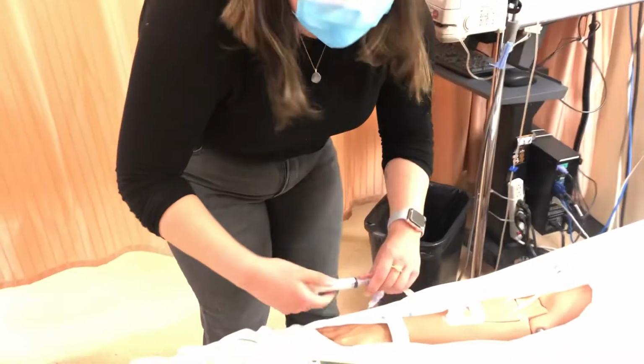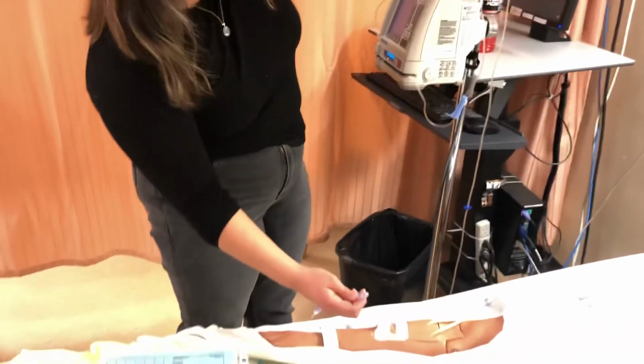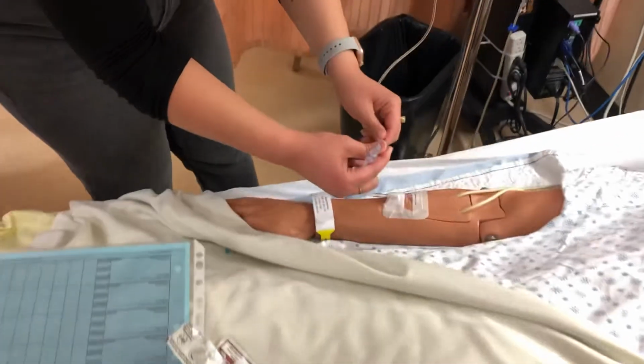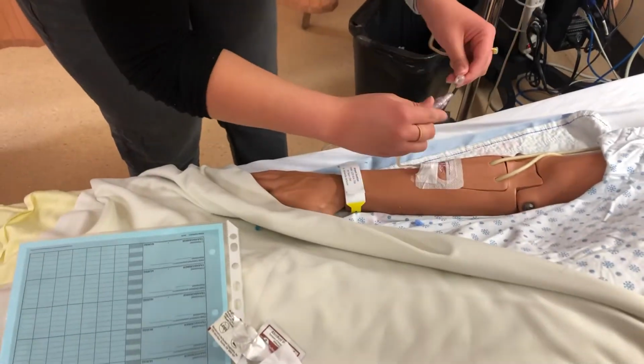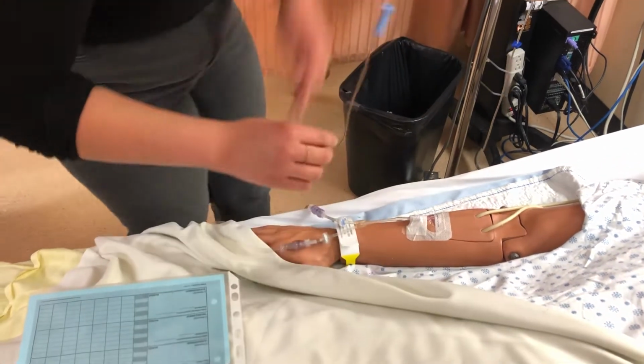Alright, so now I can... And there I have my patient's, do you consent to this medication? Patient said yes. IV is patent. I can hook them up. I know that nothing is going to go through as my clamps are on, and it is hooked up to the pump. I'll undo my blue cap.